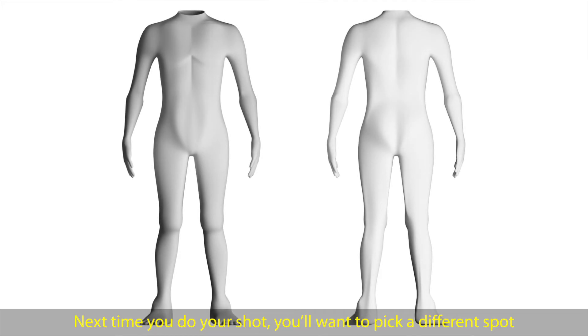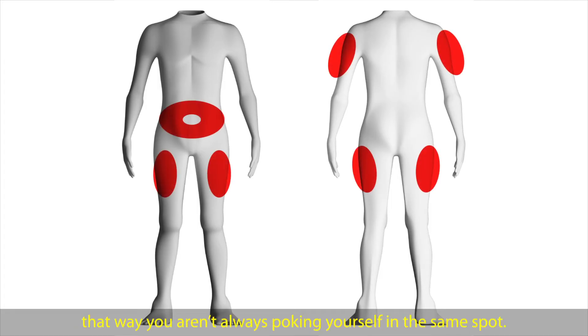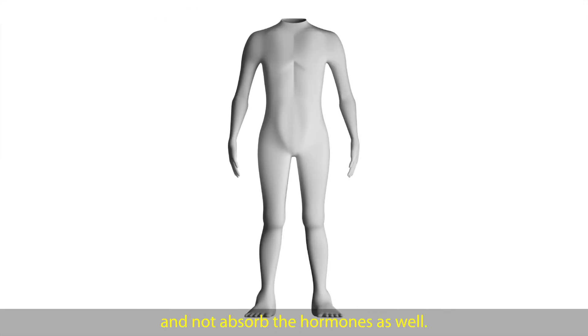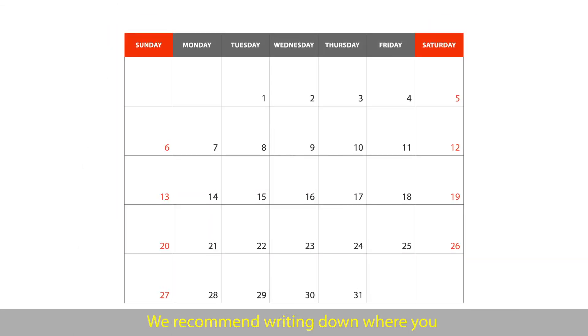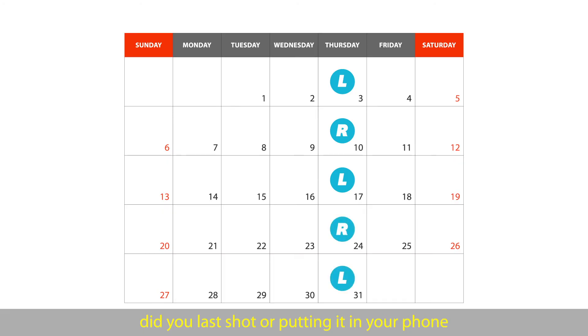Next time you do your shot, you'll want to pick a different spot on your body to do the injection, so you aren't always poking yourself in the same spot. Repeatedly doing your injection in the same place can cause the skin to become thick and rubbery and not absorb the hormones as well. Some people choose to alternate between the right and left sides of their body, while others decide to do their shots in a circle around their belly button. We recommend writing down where you did your last shot or putting it in your phone, because people often forget where they did their last shot by the time they need to do their next one.